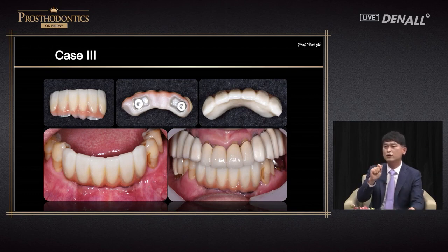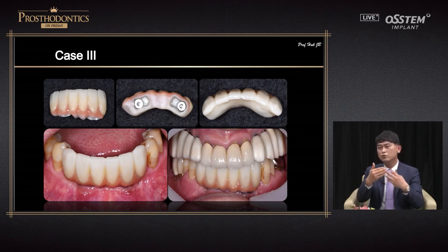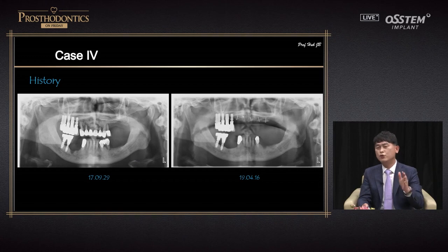Providing a self-cleaning function to the patient is very important. Relying on the surgeon for all the cleaning may not work for the maintenance, so you need to give some responsibility for the cleaning to the patient. That was a partial case. Let's go to a full case.